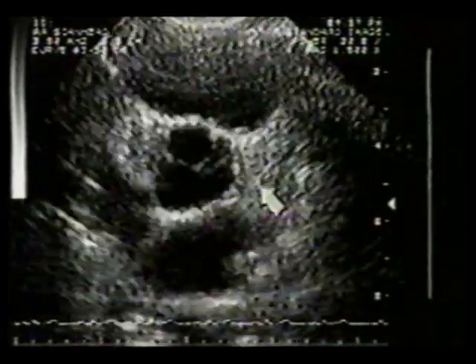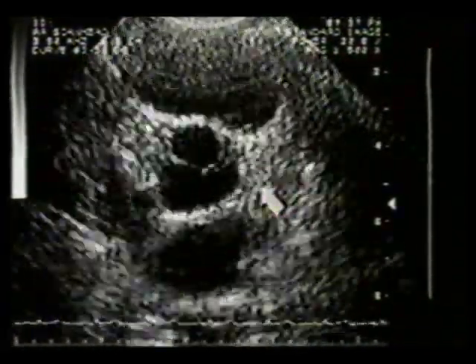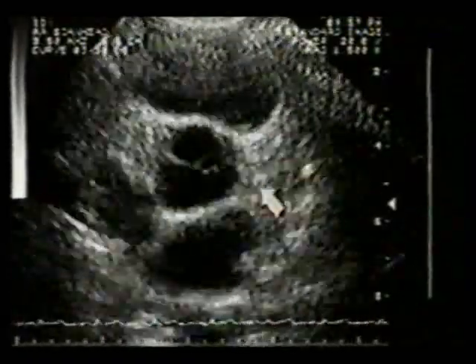In this short axis view of the aorta, we are using the zoom feature to study the ostium and proximal portion of the left main coronary artery, which originates from the left coronary sinus of Valsalva. In real time, the coronary artery is visible during only a portion of the cardiac cycle.